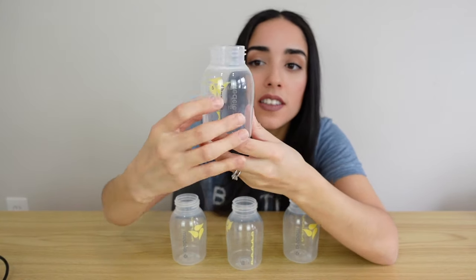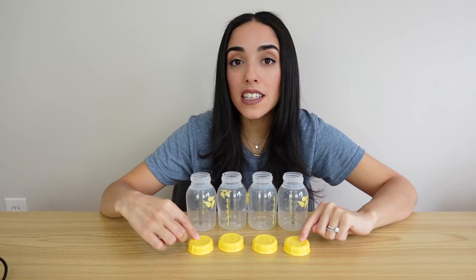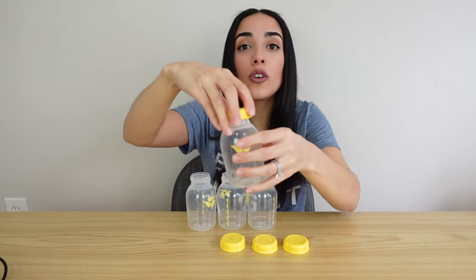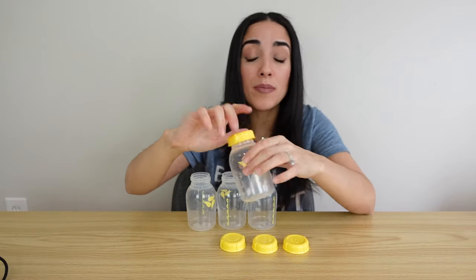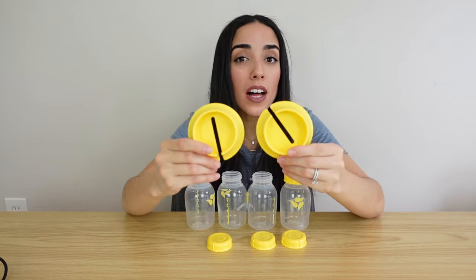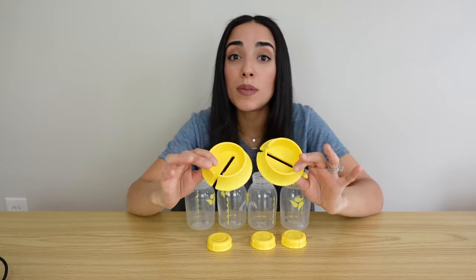Your pump also comes with four five-ounce bottles. What I really love about these bottles is that the five-ounce line is marked, so you're able to fit a little bit more than five ounces when pumping. You're also going to get four lids for your bottles, which are really nice for sealing off your milk when you're done. You also get two bottle stands, which prevent your pump from falling over and spilling your breast milk.